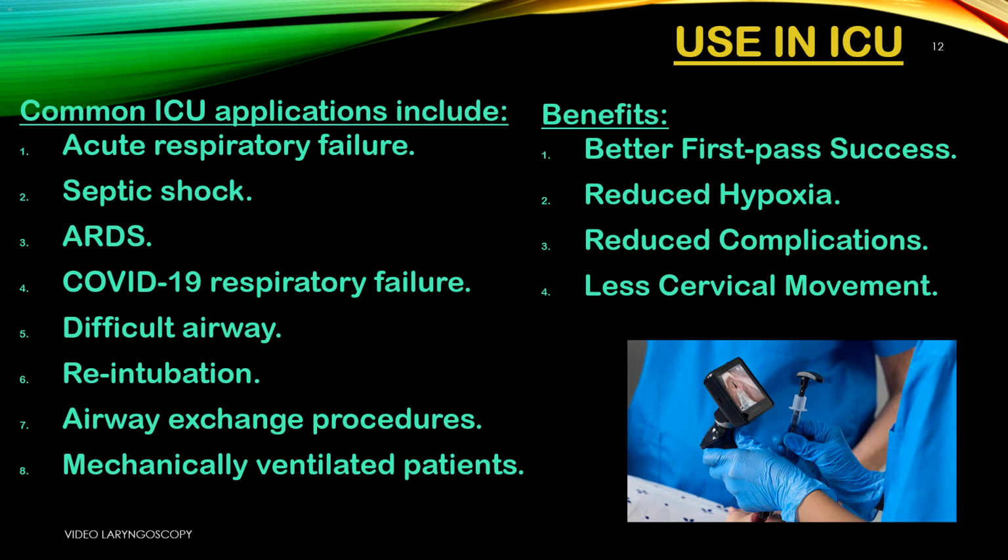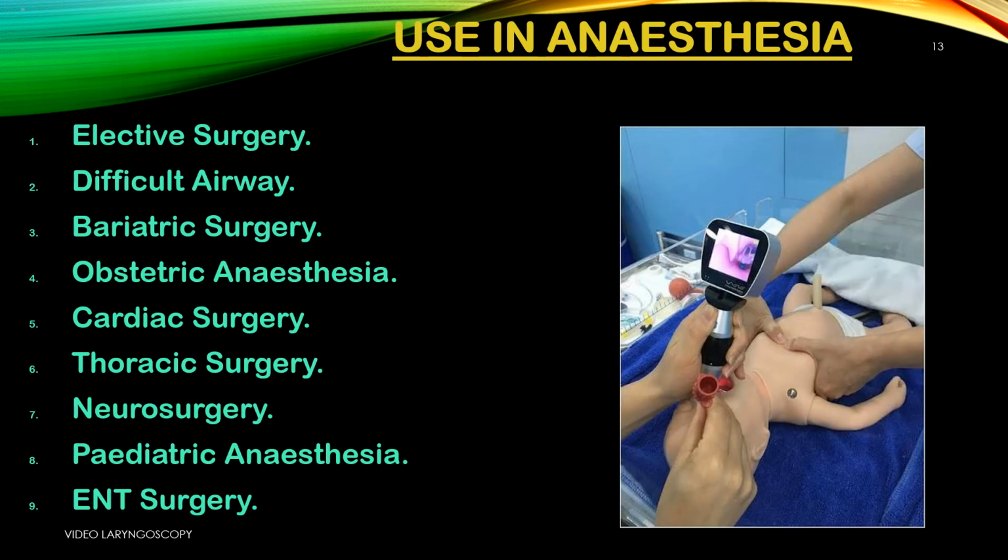4. Less cervical movement. Important for trauma or unstable neck patients. You can intubate with minimal head-neck motion. Use in anesthesia. 1. Elective surgery. Planned OR cases. VL provides a clear view and reduces multiple attempts, making induction smoother.